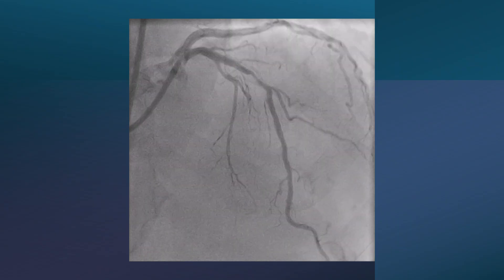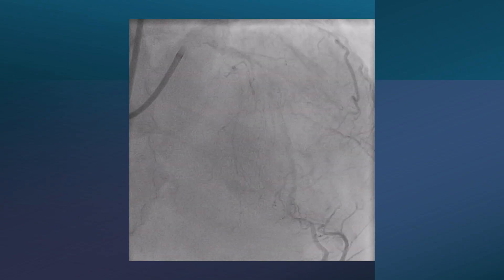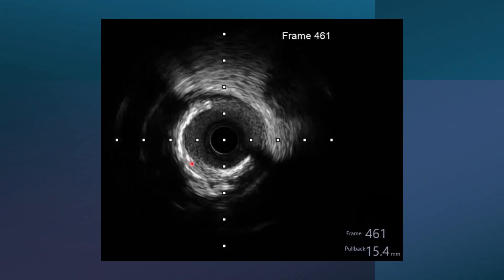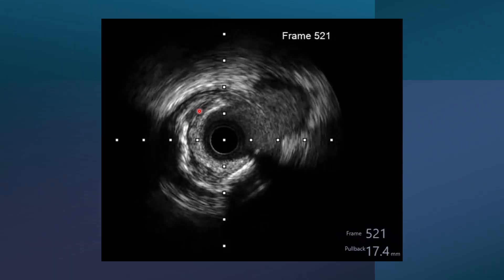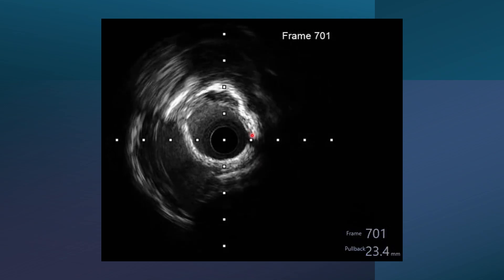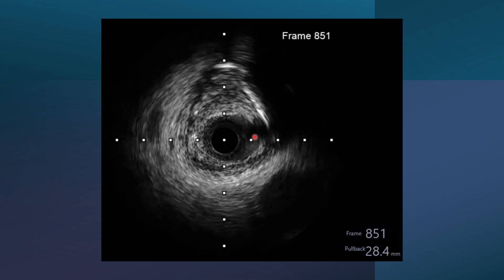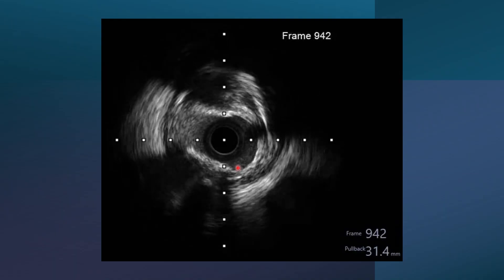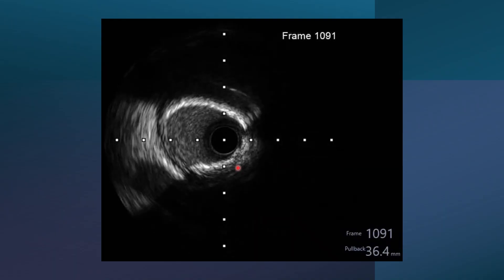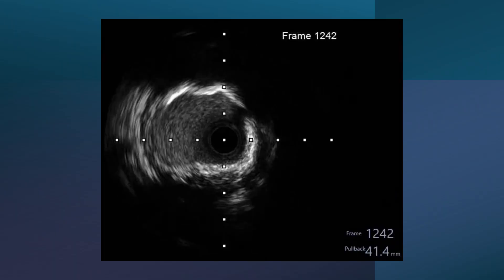Going back to the first case — an 86-year-old man with this calcification — we performed intravascular imaging. This is the pullback from distal to mid. We can see two arcs of calcium that coalesce to become more than 270 degrees. Then in the mid part, there is around 360 degrees of calcification. Here we can also see soft plaque and some calcification proximal to the lesion. Pulling back further, the artery is diseased and calcified, but it has a large minimal luminal area.